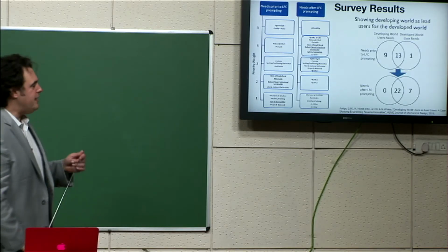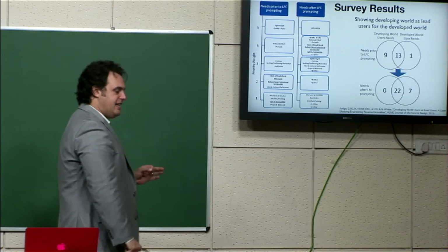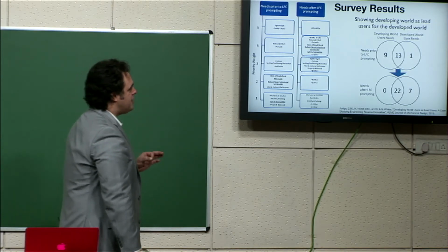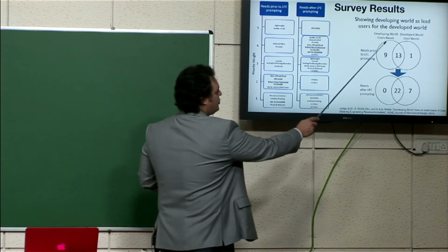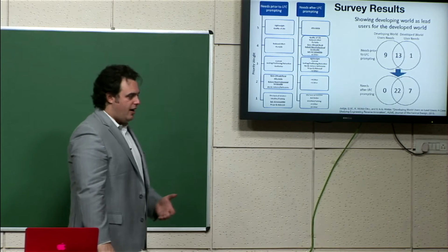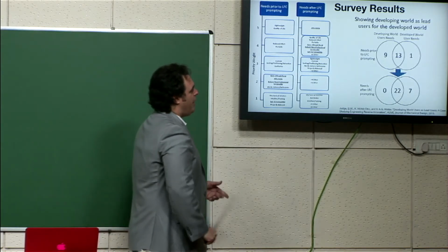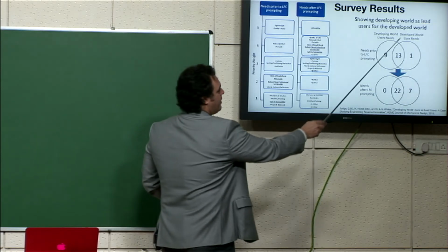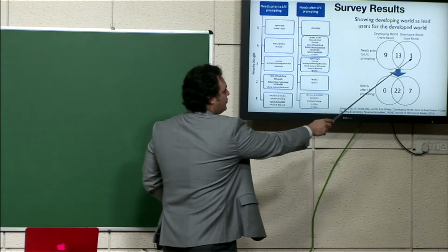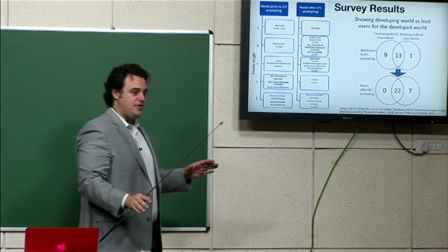Then the other thing we did is we looked at the distinct needs that were expressed by developing world wheelchair users in all of our past work, when people talked about repairability, affordability, rough terrain capability. We compared those needs to the needs of wheelchair users, both expressed before they knew about the LFC, right?